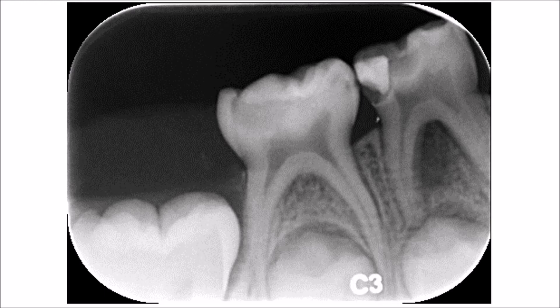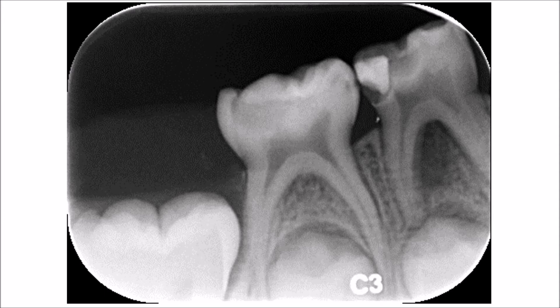Another periapical radiograph of the deciduous teeth. Deciduous teeth are affected by caries just like the permanent teeth, and in this radiograph, you will see on the second molar — the deciduous molar — that there is a mesial proximal caries.